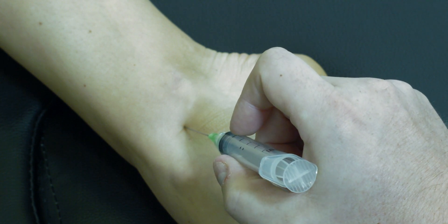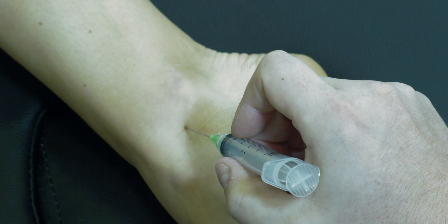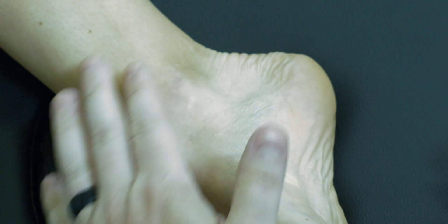Advance the needle about a centimeter, aspirate to ensure that you're not intravascular, and then inject whatever injectate you may be using. The needle can then be removed, the skin cleaned and bandaged — and that's our tibiotalar injection.